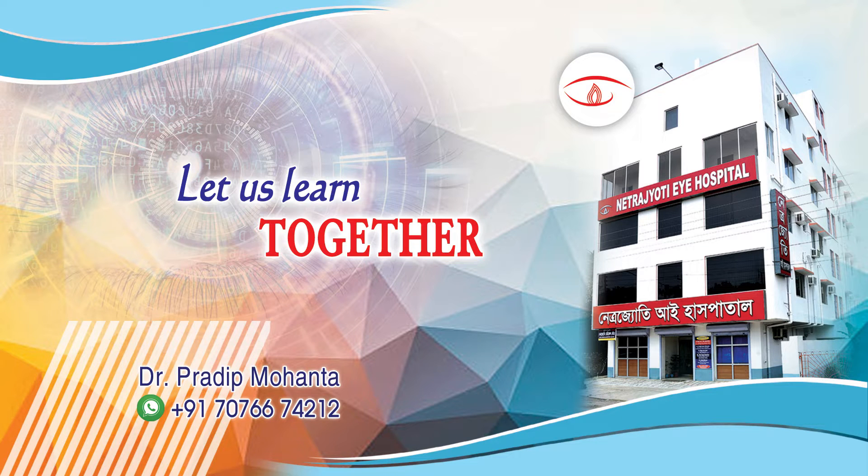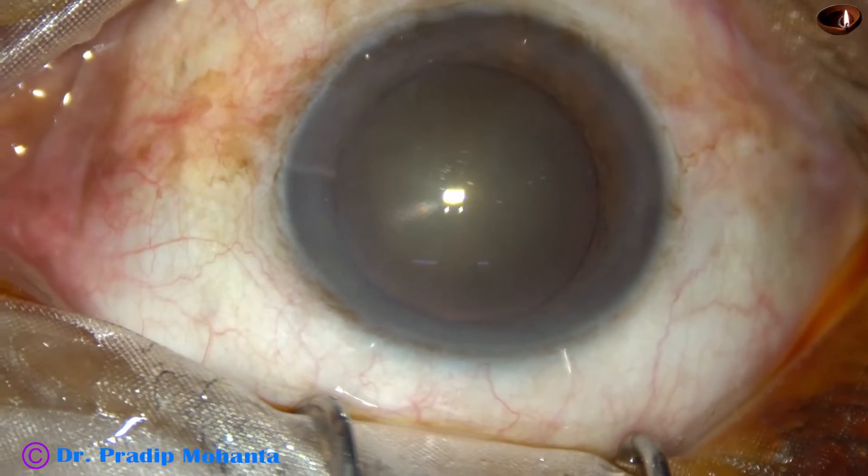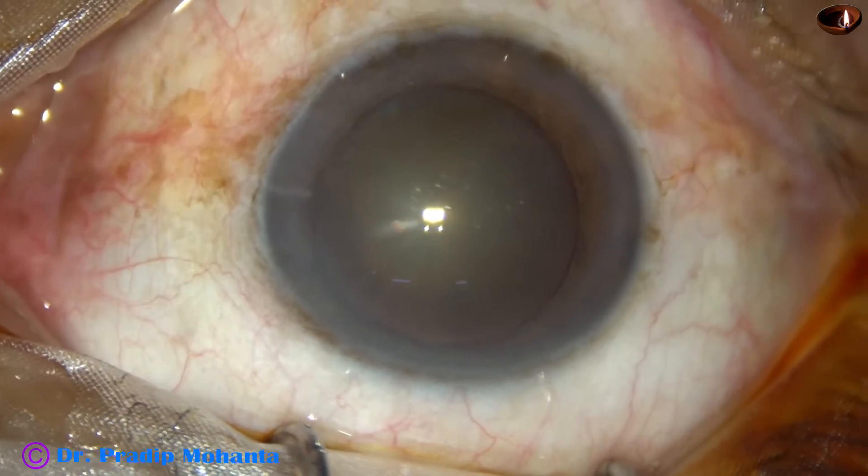This video is intended for ophthalmology residents and eye surgeons all over the world who want to learn small incision cataract surgery.